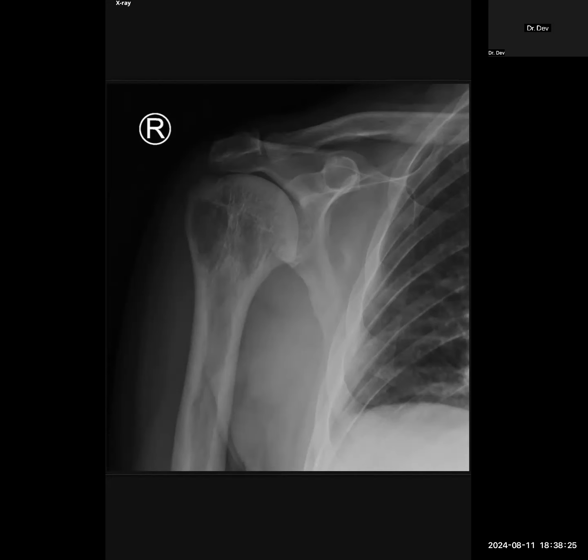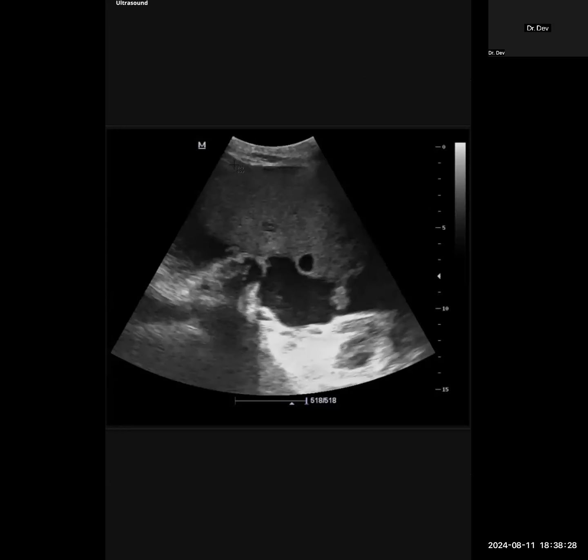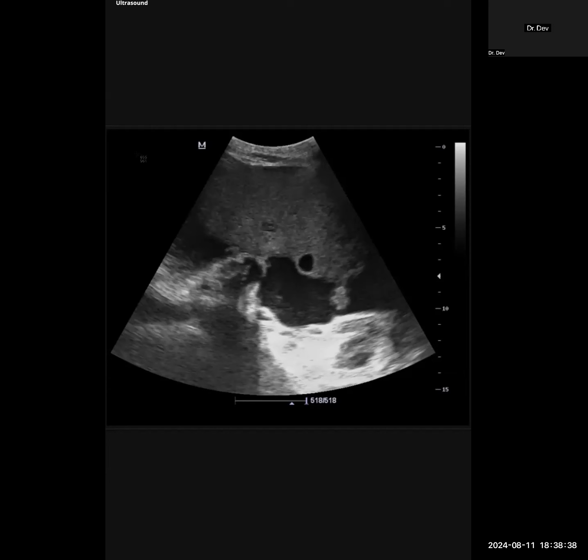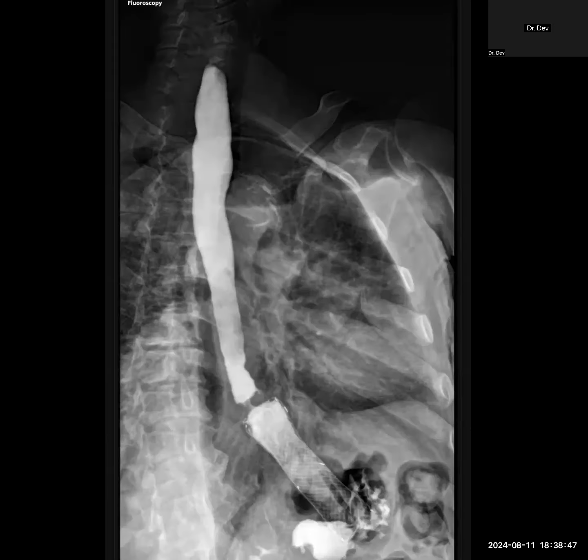Second one, this was very well done. This is a case of Krukenberg's tumor. I would have liked it a bit more if you had considered the possibility that it could be primary bilateral. You did say it, just didn't use those words. Otherwise, this is very well done. I would give you a 7 for this as well. You described it well, and you mentioned what you do in your usual work cases as well.